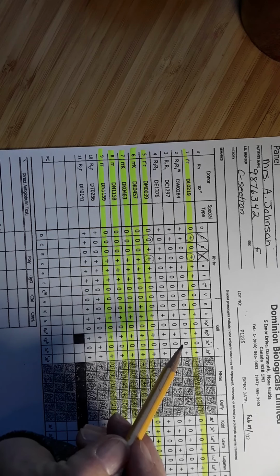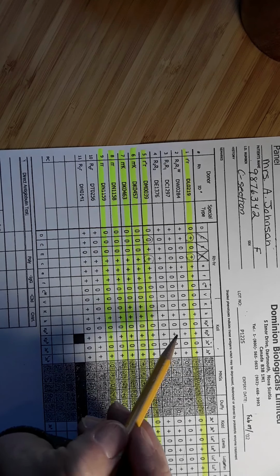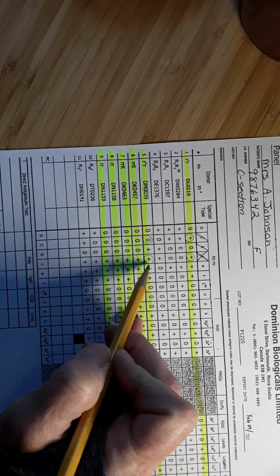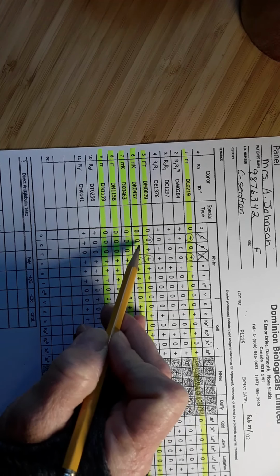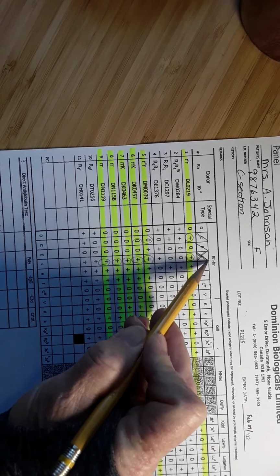These antibodies may be excluded, what we're doing now, putting slashes, based on non-reactivity of the patient's plasma with 2 homozygous cells. Okay, well, do we have 2 homozygous? Well, sure, we have many homozygous. Here's another one, another one, another one. So that's why I have 2 slashes on it.